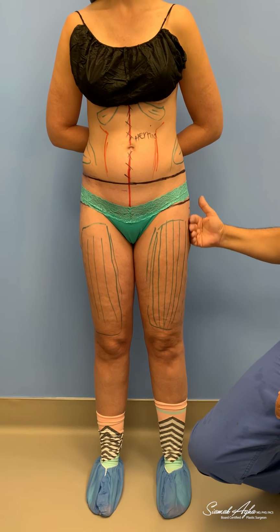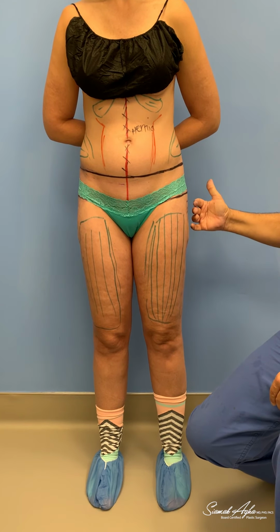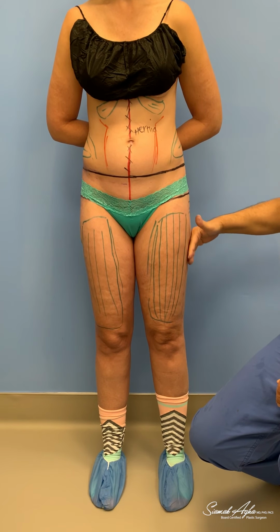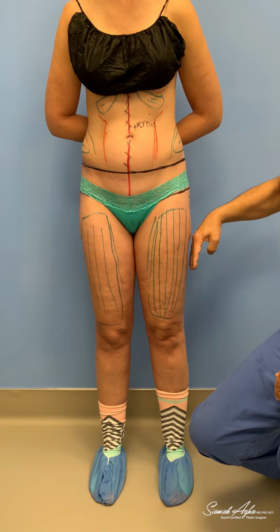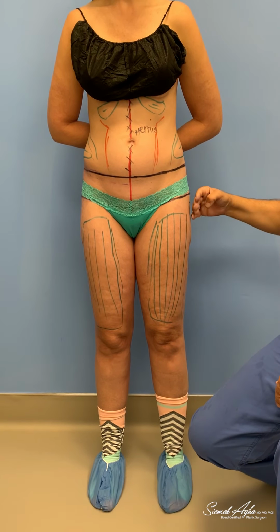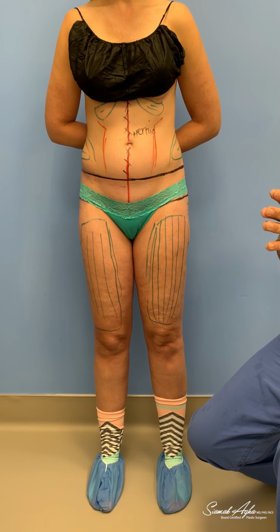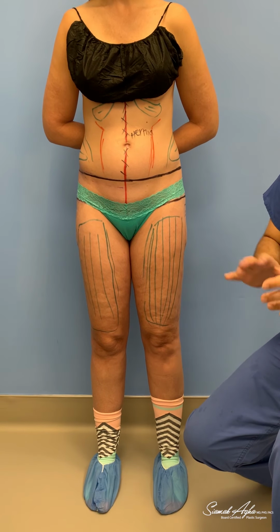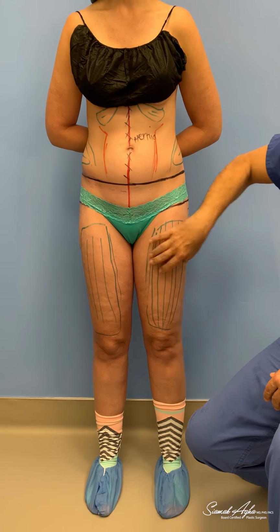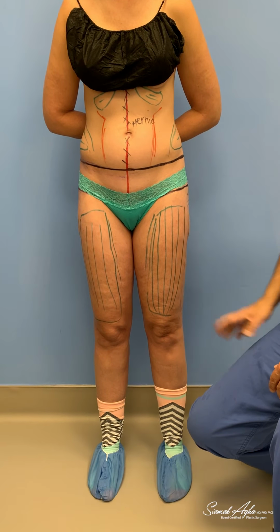We are going to be doing liposhifting here, and liposhifting is essentially using power-assisted liposuction to loosen up all of these tissues with the vibration of the power-assisted liposuction, so that the tissues are looser and I can put fat in there, and the fat can seep to other areas and make a smoother contour. In the front, we're going to be removing fat. In the back, we're going to be removing fat, and we're going to be utilizing that for the augmentation.